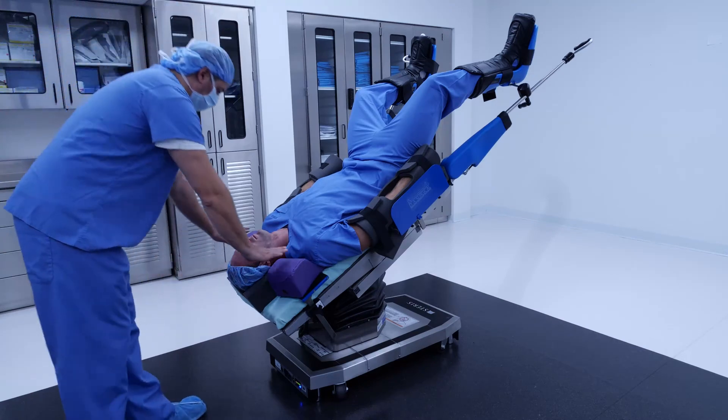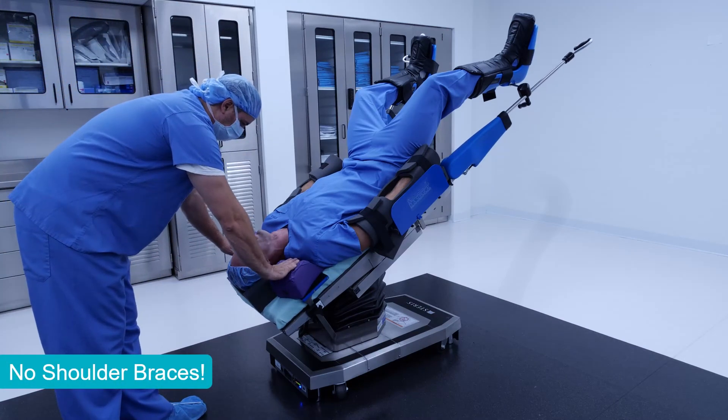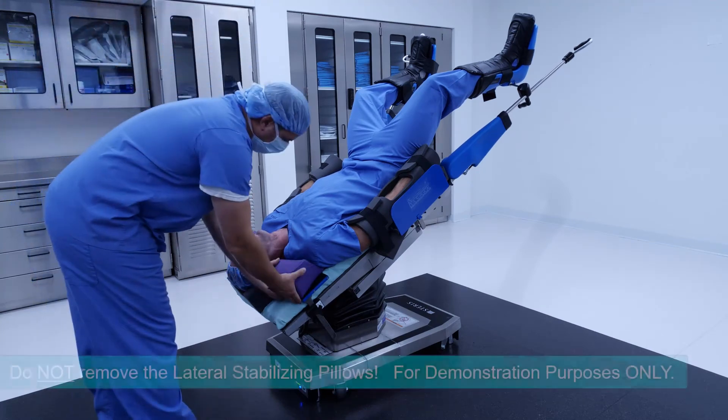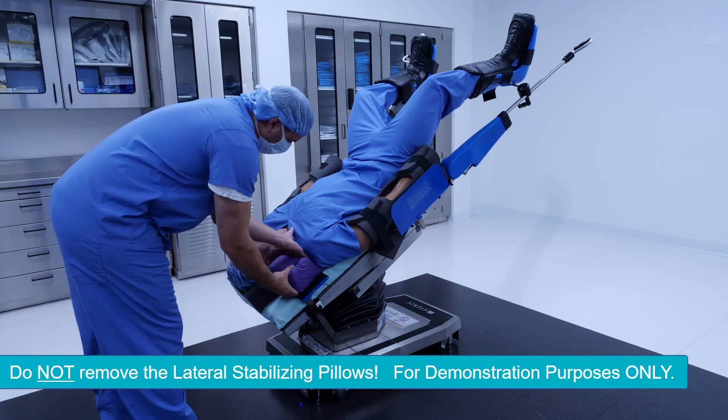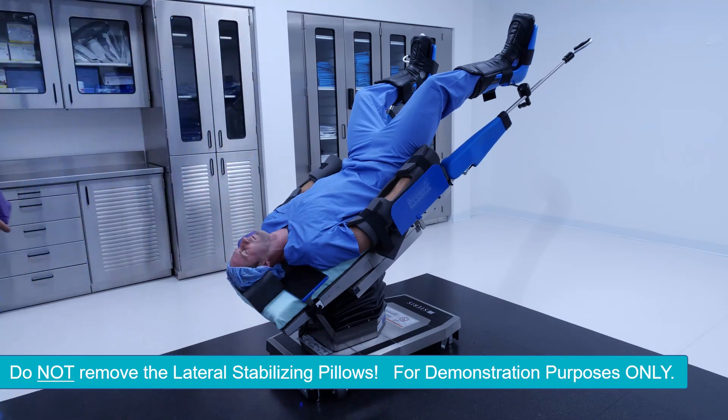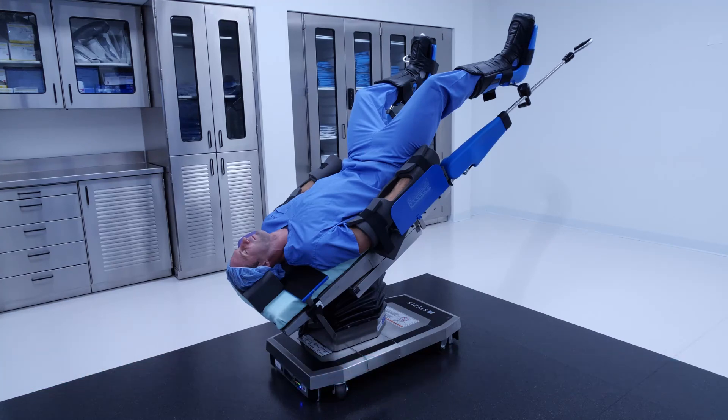Here, we illustrate how the lateral stabilizing pillows are completely soft and non-structural. Do not remove the lateral stabilizing pillows while a patient is in Trendelenburg. For demonstration purposes only, we have removed the lateral stabilizing pillow to show that the patient will not move.